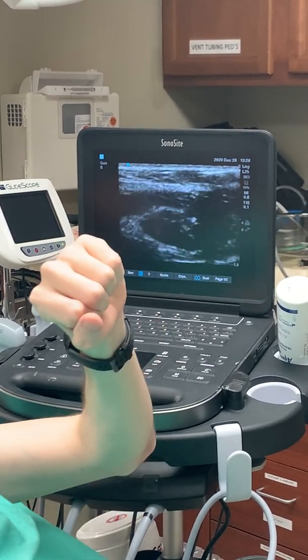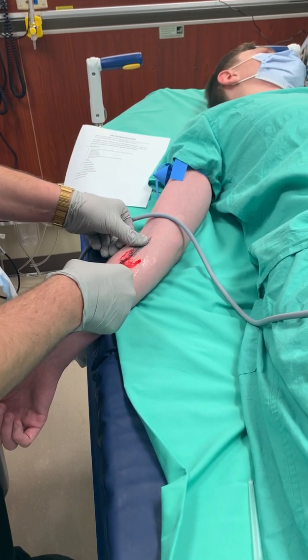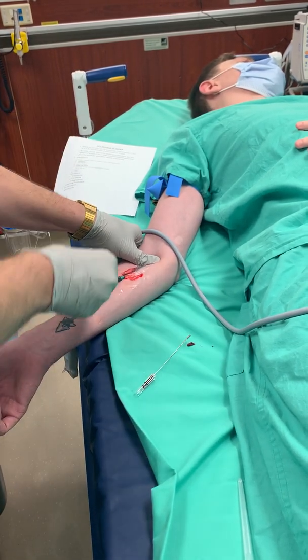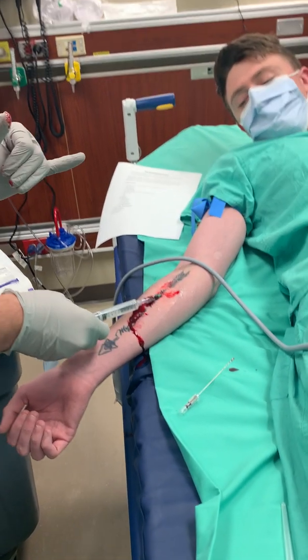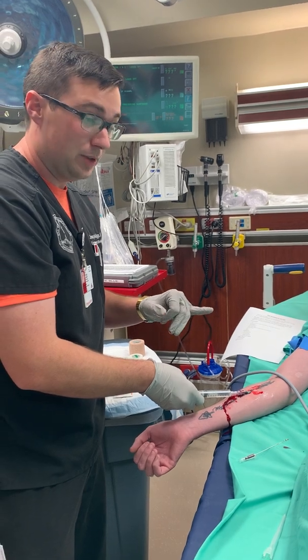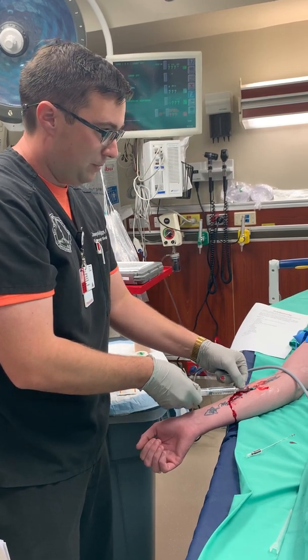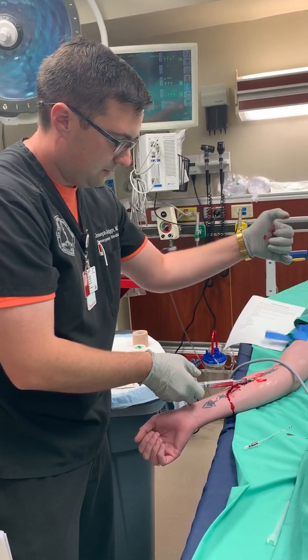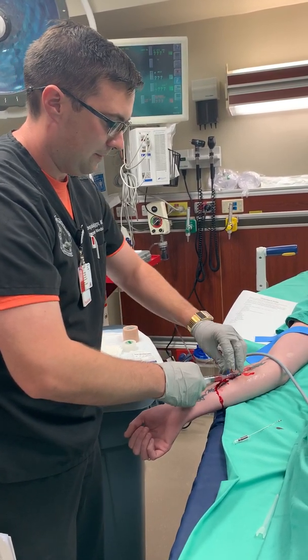Now I take my ultrasound, drop it, keep my right hand steady, and with my left hand thread the catheter through. This is a two-and-a-half-inch catheter so I need to occlude pretty proximal. I put my saline lock on right there. All this ultrasound gel makes this a high-risk time to pull the catheter out, so my immediate priority is getting it secured. I pull back a little bit — nice blood return. I release my tourniquet and flush. The flush goes easy, so now I know I'm in.